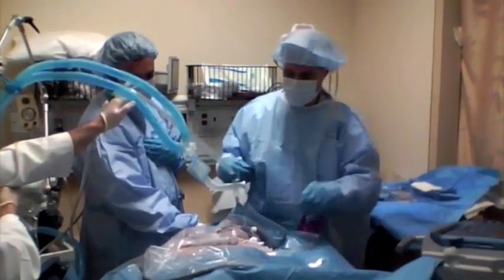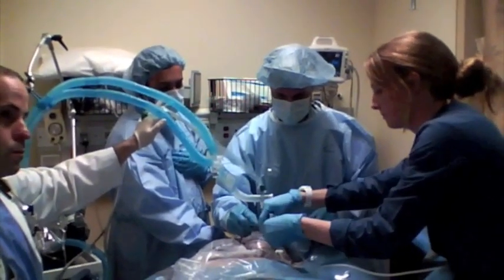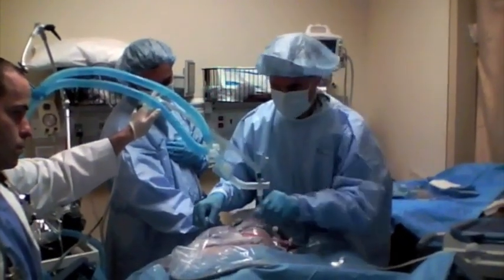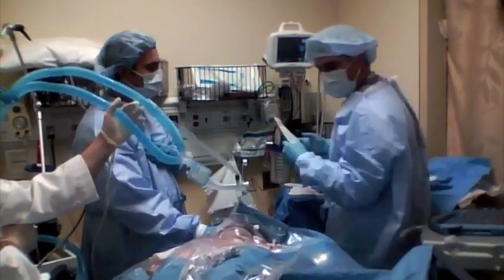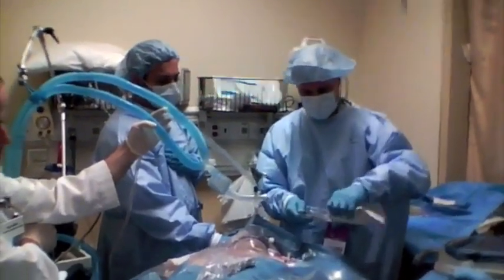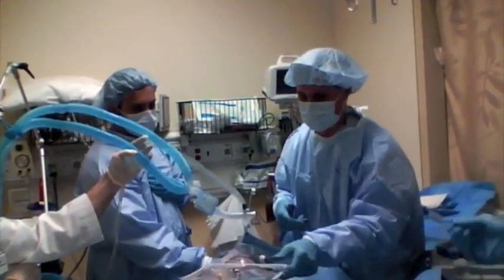I need the IV tubing — flushed. Now we've got a catheter in the superior vena cava with the pigtail going there. At this point we can open the pacer up.